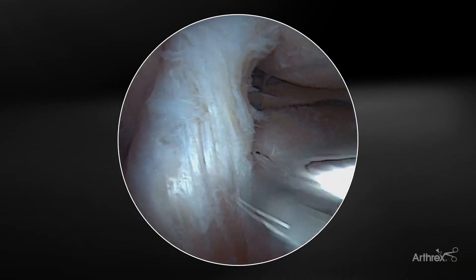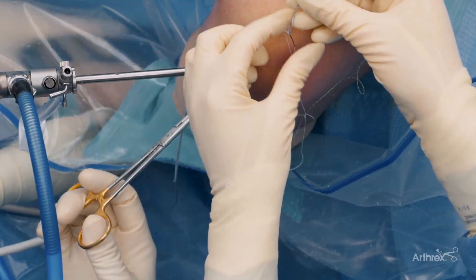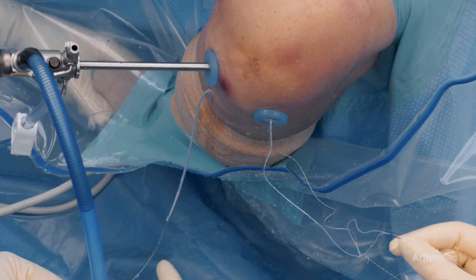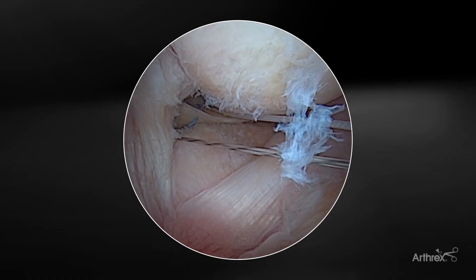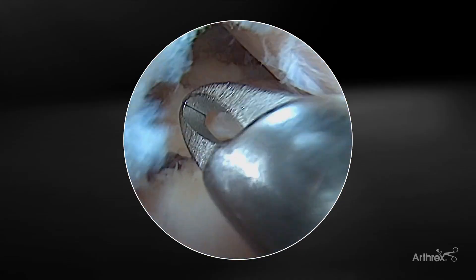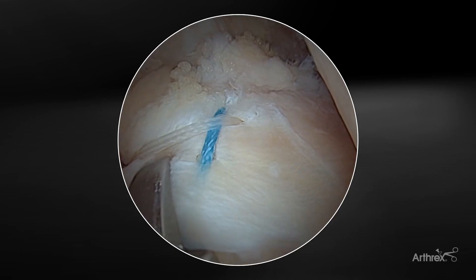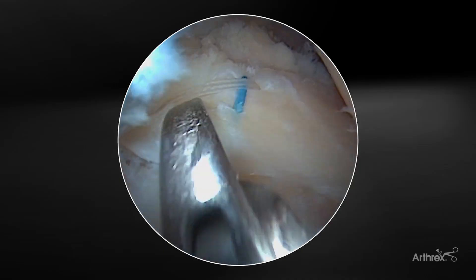We're just going to check the Mason-Allen configuration — you can see the vertical component followed by the horizontal component. The next step is to convert the horizontal suture. We'll grab the remaining conversion stitch, load it, and pass it through the sheath, making sure to take off the hemostat before passing. Load this again to the purple line and deploy. The black and white suture is the one that will be used to convert the horizontal limb. Now we have the horizontal and vertical limbs ready for final tensioning. With the Mason-Allen configuration, I like doing sequential tensioning starting first with the vertical blue stitch and then the white stitch, alternating gently back and forth until you affect the final repair. Alternating stitches, you can see how this holds it down — and there's our final meniscus root repair with the Mason-Allen configuration.